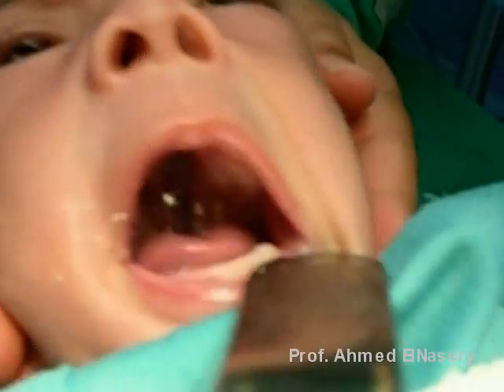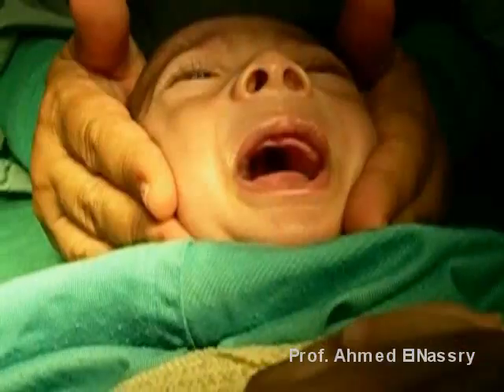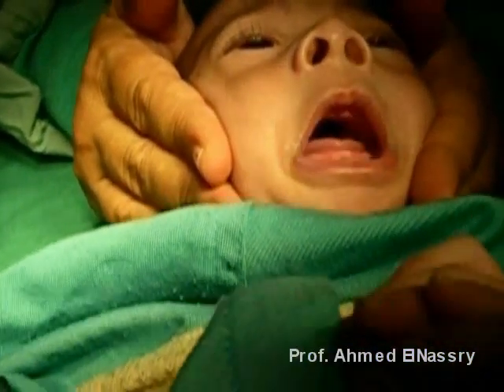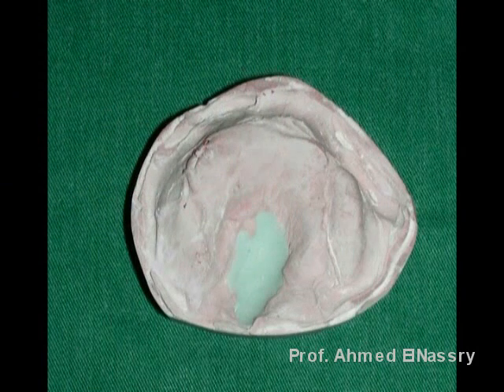Baby Elias has a cleft in both the hard and soft palate. Because the mouth of the baby is too small, we have to construct a custom tray to take the impression.